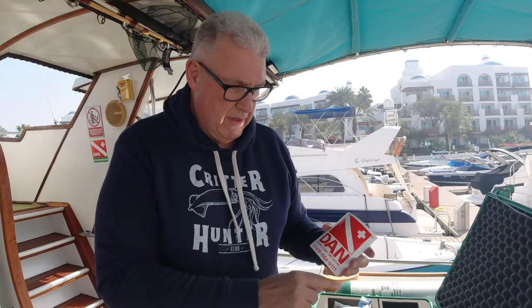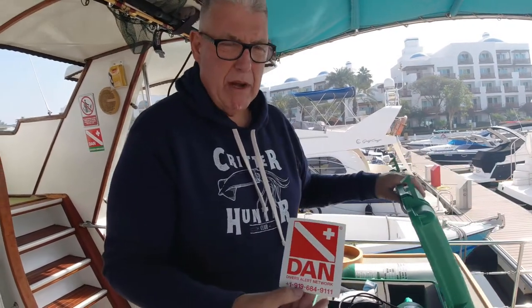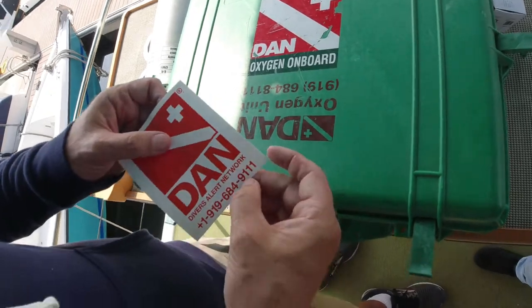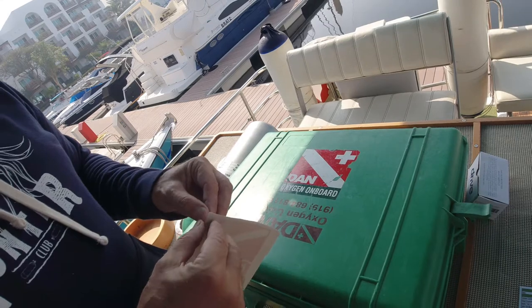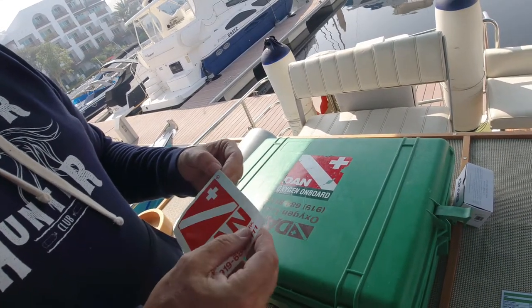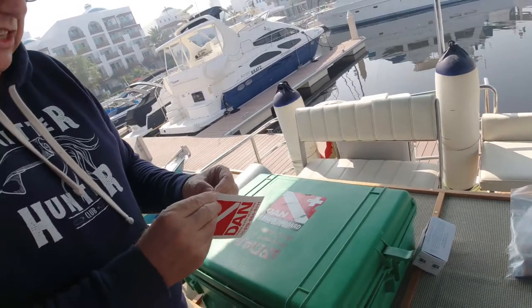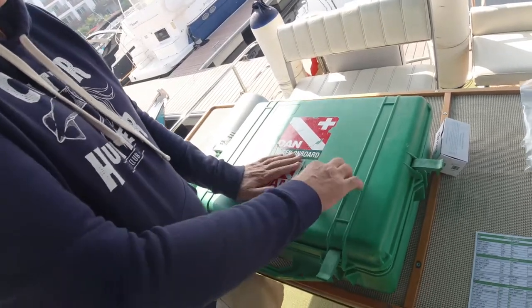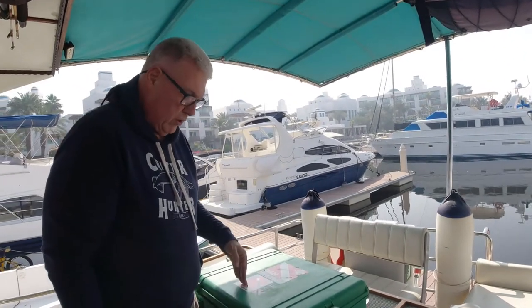Finally we get a DAN USA sticker with the help number. We're covered by DAN Europe, but for American viewers the number changed — it used to be 684-8111 and is now 9111. I'm going to put this sticker on and also make one with the European number, so in an emergency we know who to call first and who to call second.